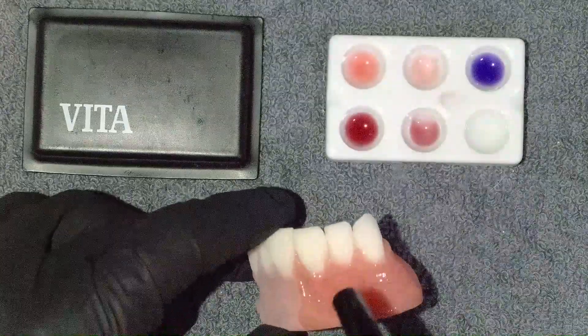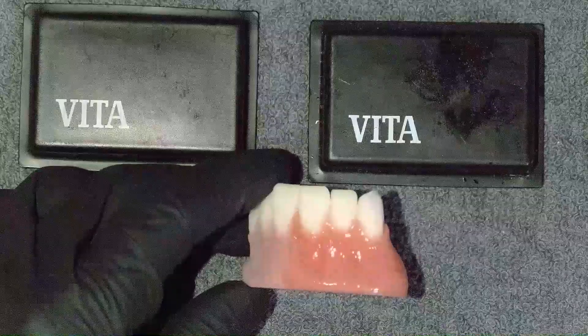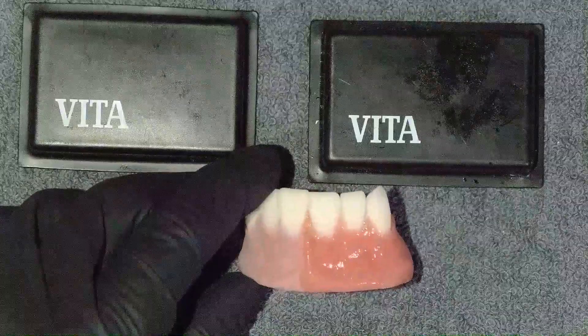Let me cure this one real quick. After curing it, we can see a very subtle general characterization of the gingiva.